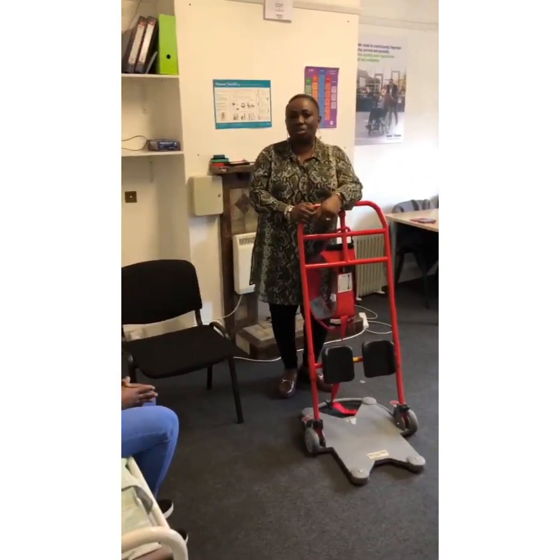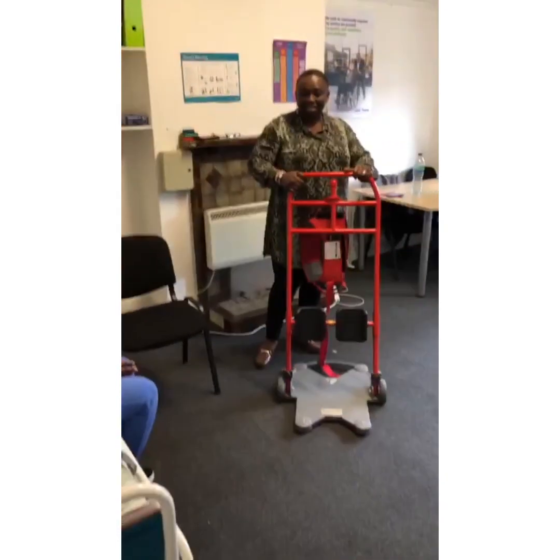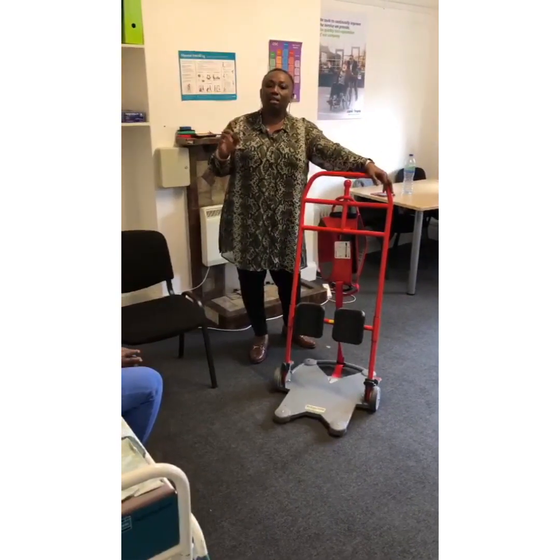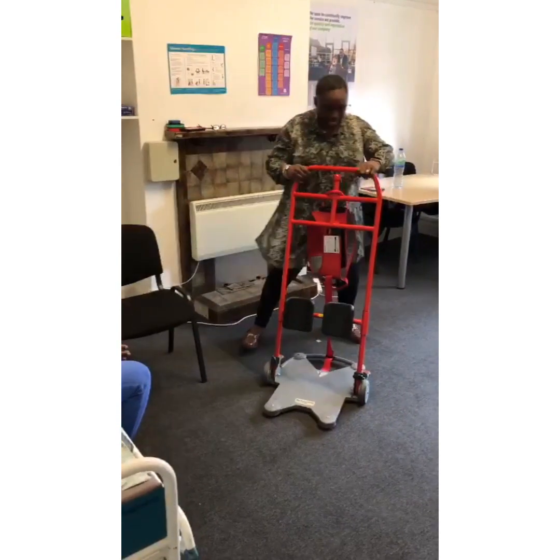I have my wonderful colleague here — Cheesab. Say hello to your friends out there! Okay, so let's get started. Let's assume Cheesab just needs one carer because she can bear her weight.